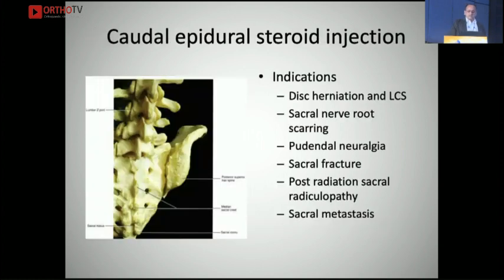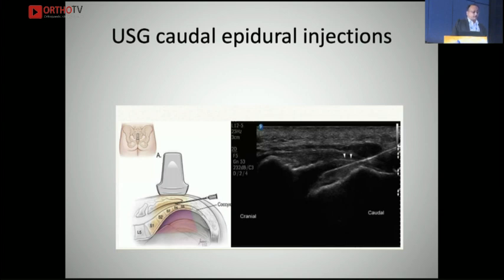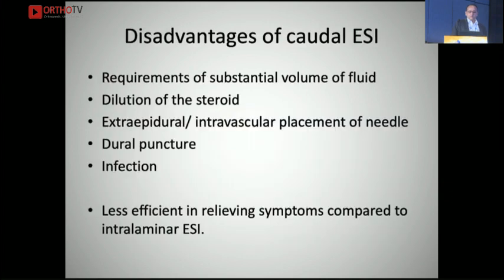Caudal epidural injections, yes, we rarely do them now, but there are certain indications. It can be done both blind and with image intensifier. With image intensifier, it's preferred to see the placement of the needle, the dye, and the dispersal of the dye. Ultrasound-guided caudal epidural injections are also available.